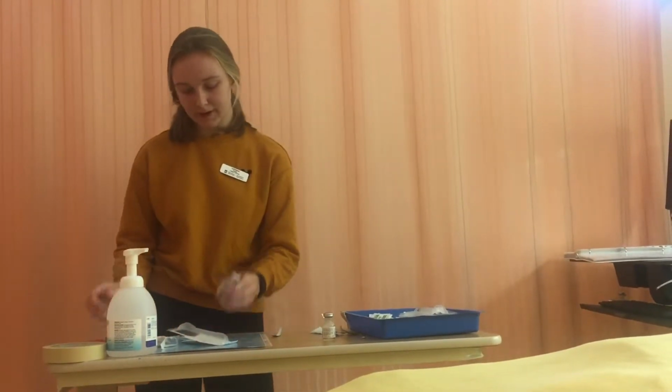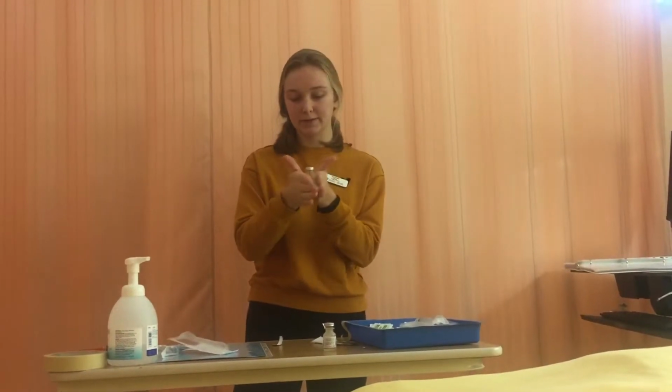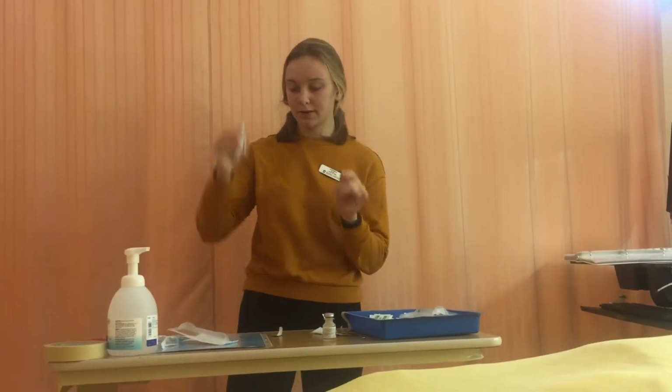And now I'm going to roll the vial between my hands, making sure we don't shake it, because I don't want to get any air bubbles into the medication. So I'm going to roll it, and it looks like it's reconstituted. There are no chunks of medication, and it looks all even throughout.